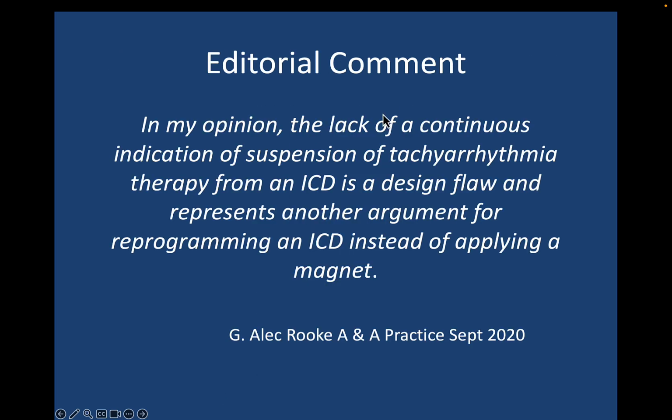Okay, now it's interesting because regarding this tone stuff, Gary Rourke, who's a very well-known EP anesthesiologist, wrote, in my opinion, the lack of a continuous indication of suspension of tachyarrhythmia therapy from an ICD is a design flaw and represents another argument for reprogramming an ICD instead of applying a magnet. So it is a little frustrating that there's variability in the tones emitted and that most of the devices, quite frankly, other than Boston Scientific, don't emit a continuous tone to let you know that your magnet is in the right spot.